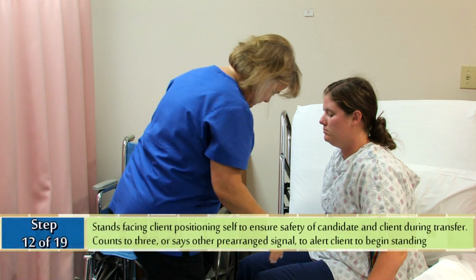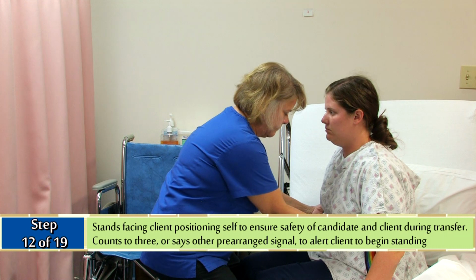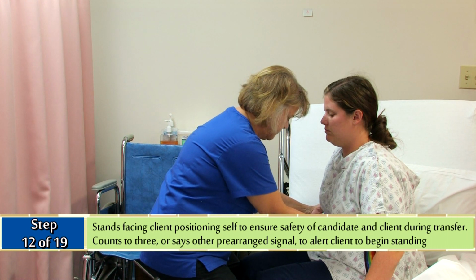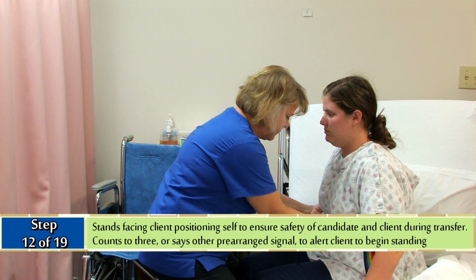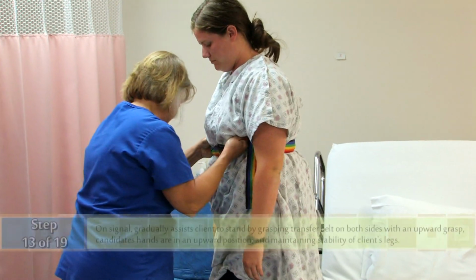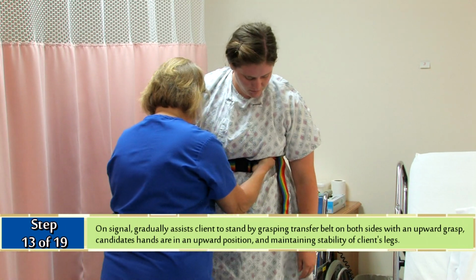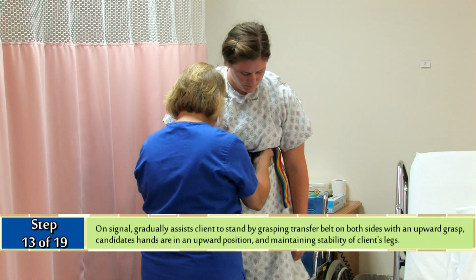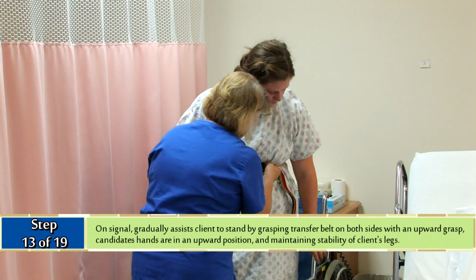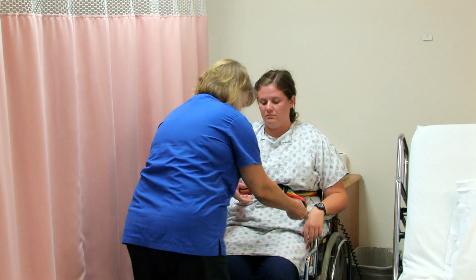Stands facing the client, positioning self to ensure safety of candidate and client during transfer. Counts to 3 or says some other prearranged signal to alert the client to begin standing. On signal, gradually assist the client to stand by grasping the transfer belt on both sides in an upward grasp. Candidate's hands are to be in an upward position and maintaining stability of the legs.